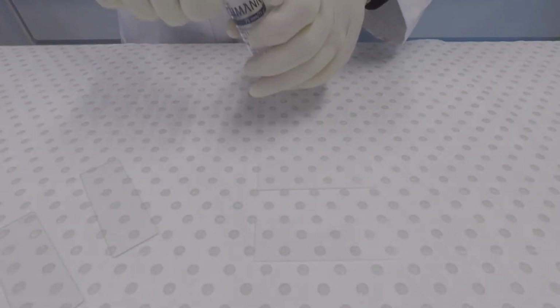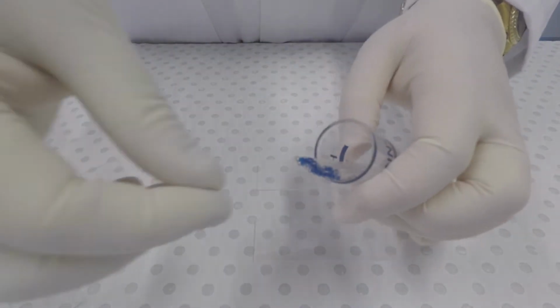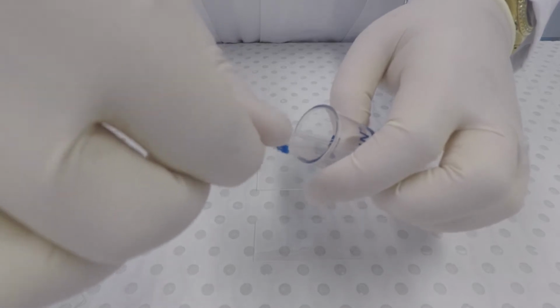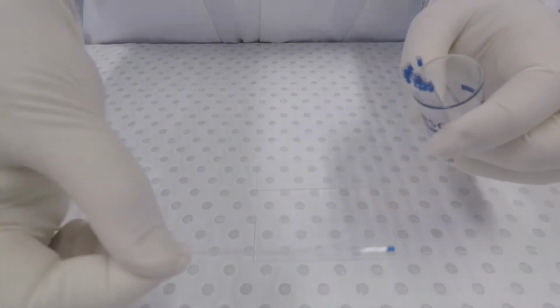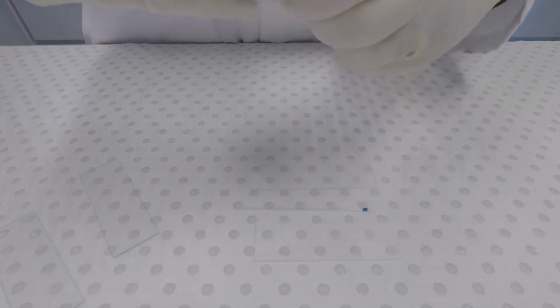Today I'm going to be demonstrating how to do a blood smear. Okay, so we have two slides on the bench coat ready to go, and we're getting a capillary tube which we'll use to draw up some of the blood sample into that will allow us to put one small drop of blood on our slide.